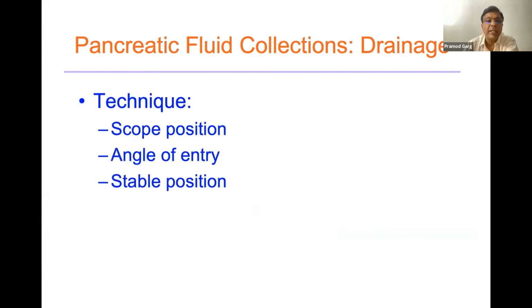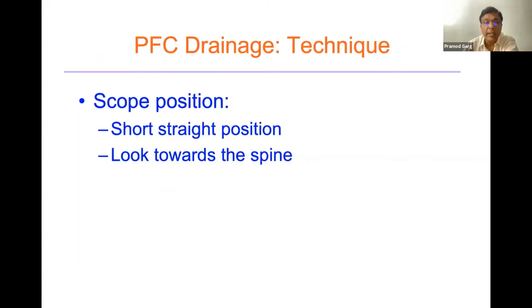7 and 10 French, double pigtail, not straight stents. Now, in terms of technique, I'd like to emphasize a couple of points. What should be your scope position? What is the usual angle of entry? And most important to my mind is the stable position of the endoscopist.